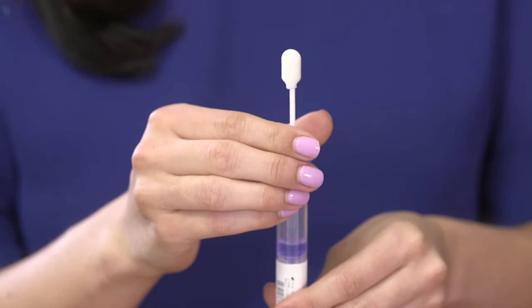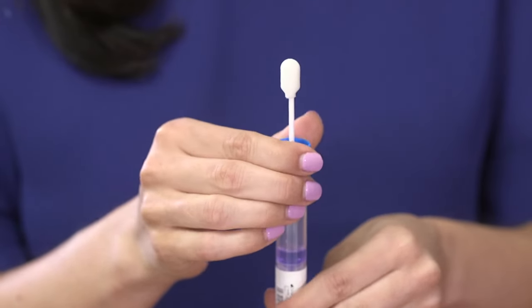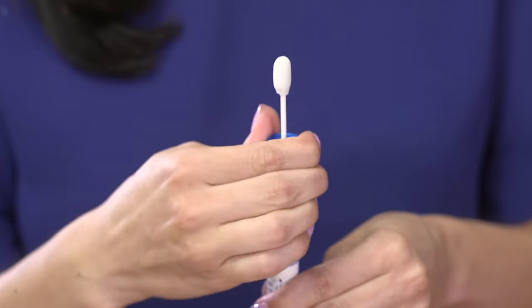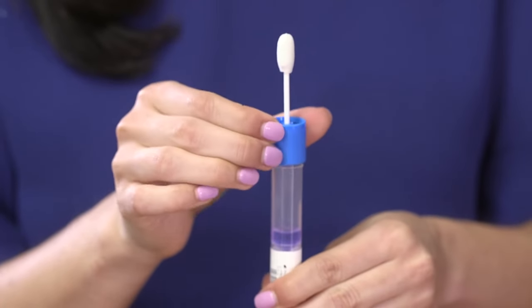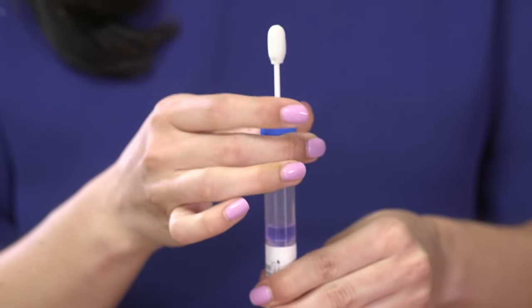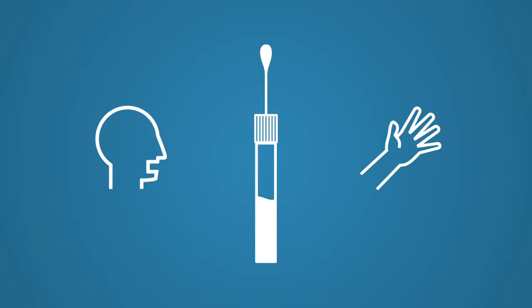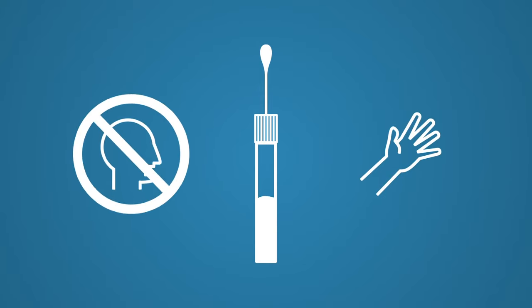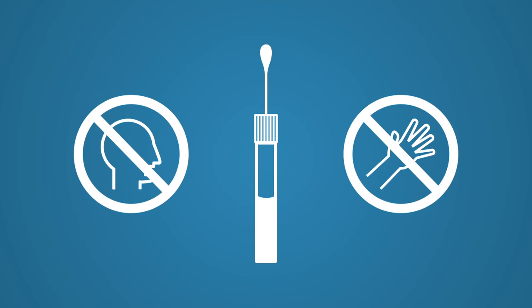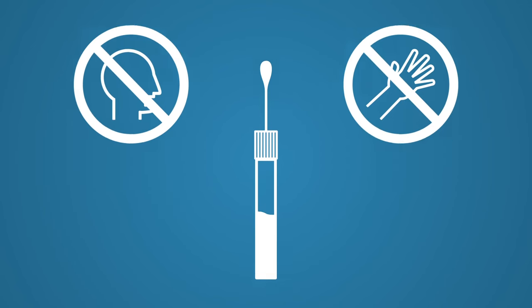Hold the tube upright to prevent the liquid in the tube from spilling. Unscrew the blue cap from the collection tube without touching the sponge. Do not drink or swallow the liquid. Wash hands with water if the liquid comes in contact with your skin or eyes.